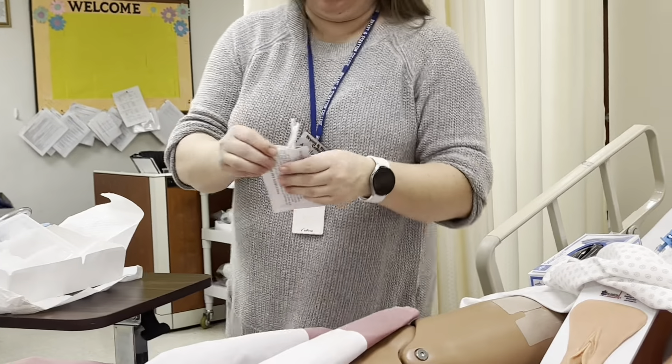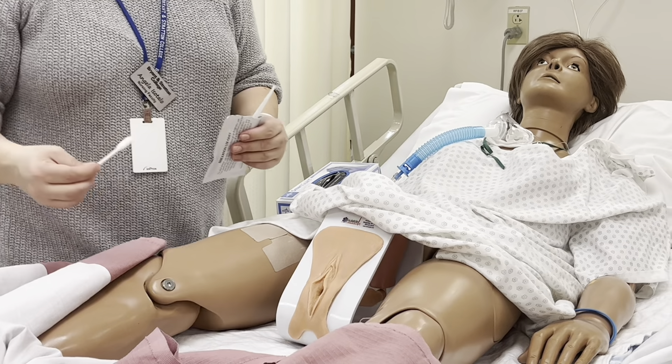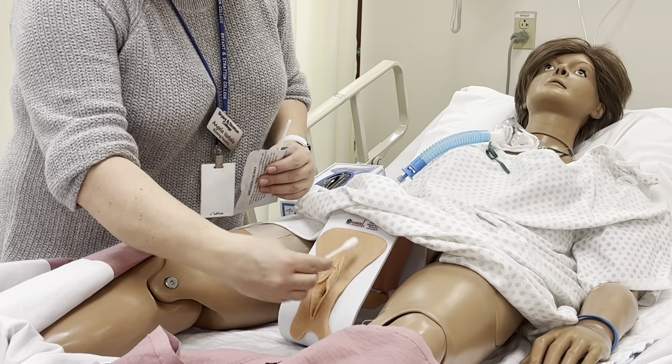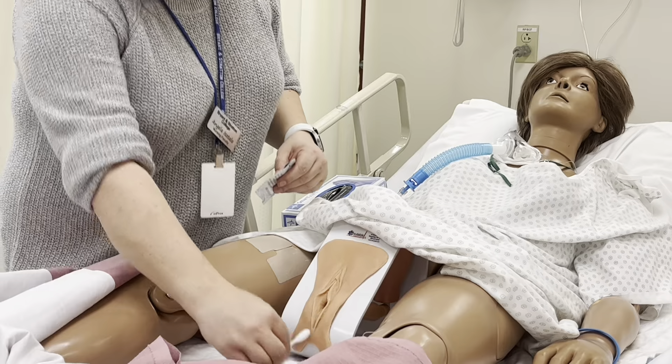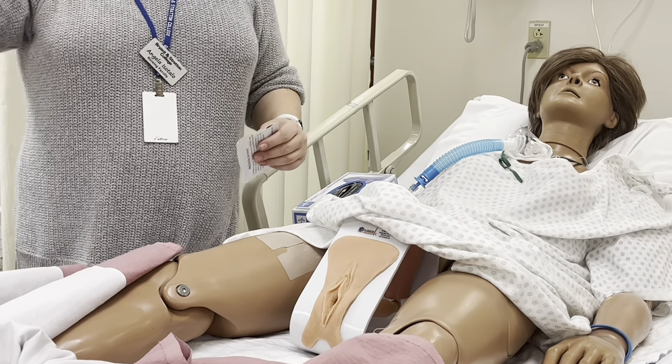Instead of the cotton balls, you are going to take the swab and swipe down. Can you see how it is wet now? So I can actually see. Put it off to the side. Clean on the outside, clean on the outside, or around the tip — around, around.